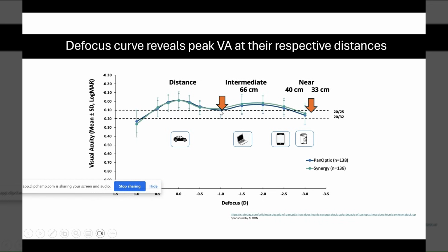Now, companies today are trying to bring trifocal IOLs onto the EDOF platform. One example is that you had the EDOF lens Symphony, and then they launched the Synergy lens on the Symphony platform. What they are trying to do is not only give the patient intermediate and near vision with the trifocal IOLs, but also fill up the vision in these areas by launching their trifocal IOLs on the EDOF platform, so that the vision does not fall even at the far intermediate.